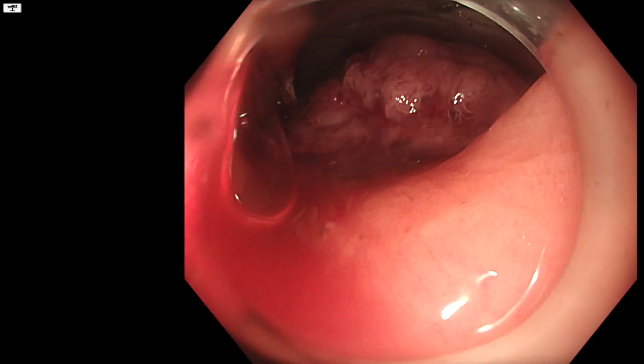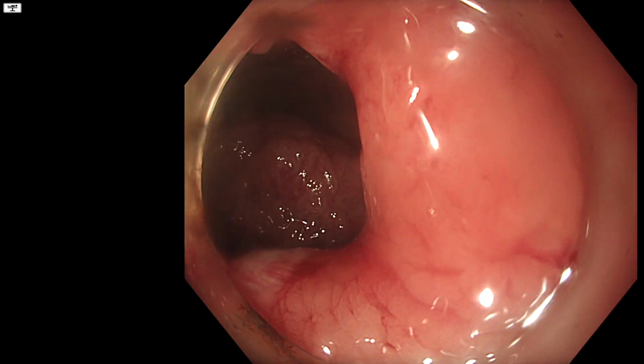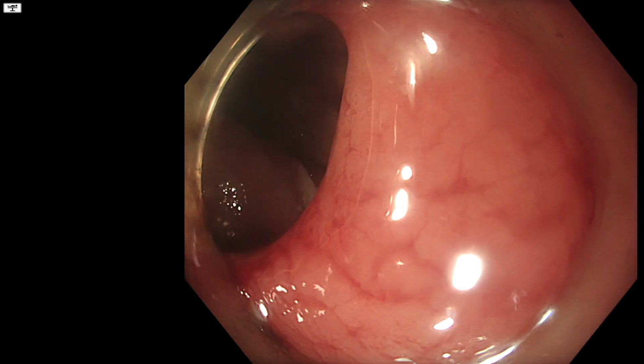So after a very stressful couple of minutes, we finally managed to control the bleed.